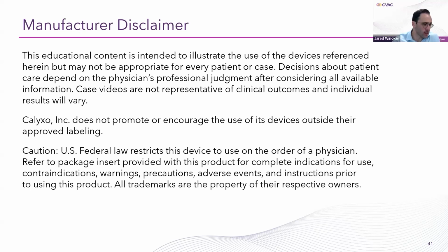Yeah, I have a similar approach. I don't do the retrograde pyelogram, but generally in placing the wire in, if we're going for the route of an access sheath, a dual lumen is going to be inserted, which, at least the ones that many use, is about 10 French. So you can already start to get a little bit of that haptic feedback about the orifice or perhaps anything upstream about how easily it's going to go. And I do also do a serial dilation using the internal stylet first.